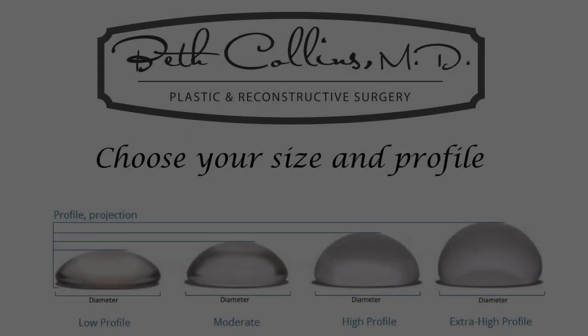So to me, and I don't have any capsular contracture, so it's easy for me to say that I really prefer it, but you really do need to think about animation, because I think that it's a lot more common than people give it credit for, and that's just where I am. If you get a problem with it, just remember, we could always flip the pocket. We could go back in and change it.